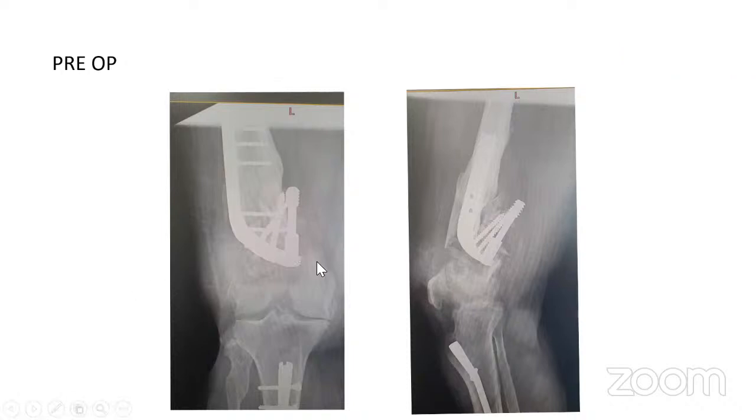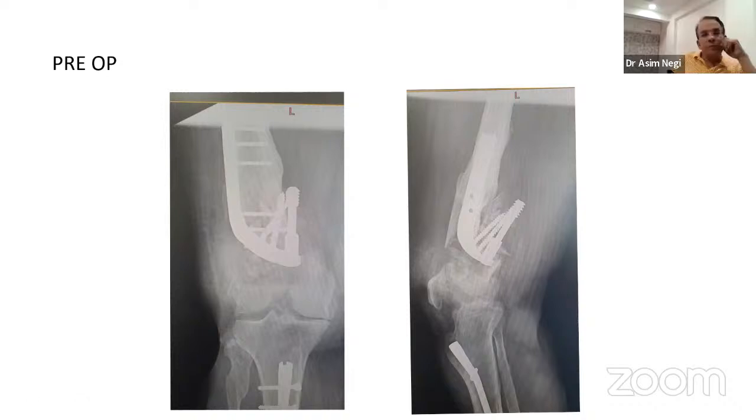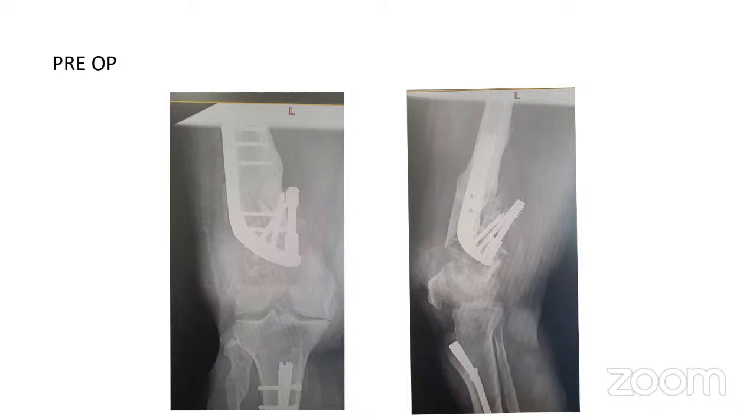Sir, is everybody able to see my screen? It's some funny implant. Sir, the tibia nailing is not done by me. It was done somewhere in KM Hospital, Bombay, by somebody. I operated on the distal end of the femur. The patient was walking. He met with another accident and he landed up with this.